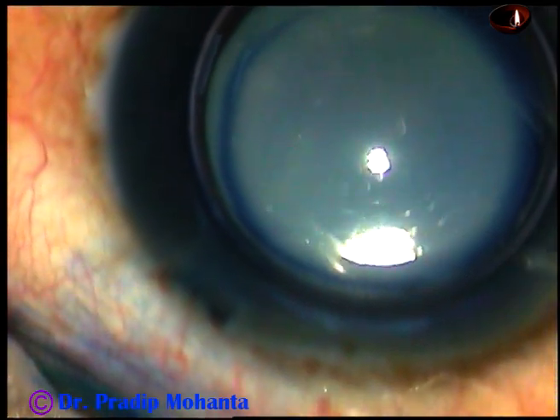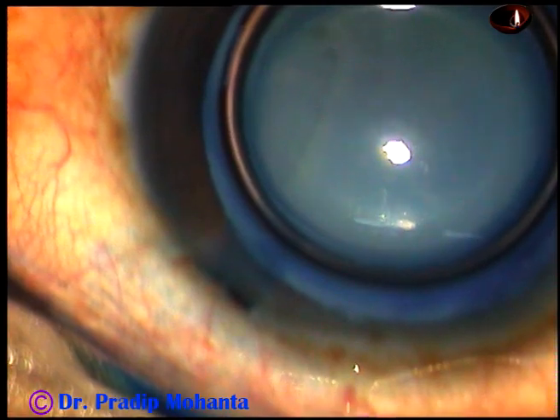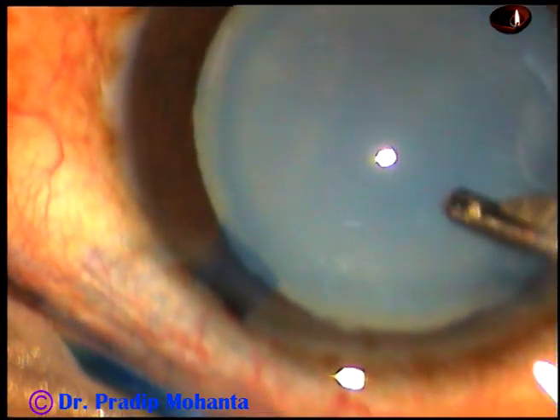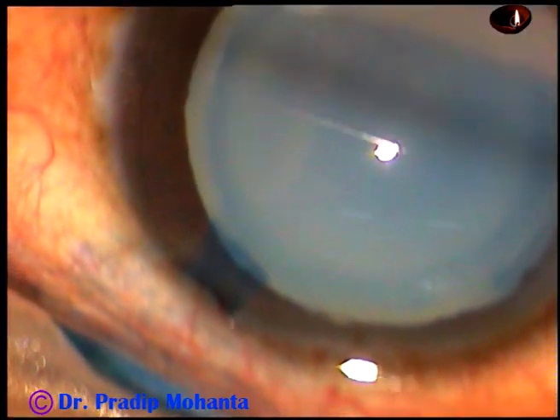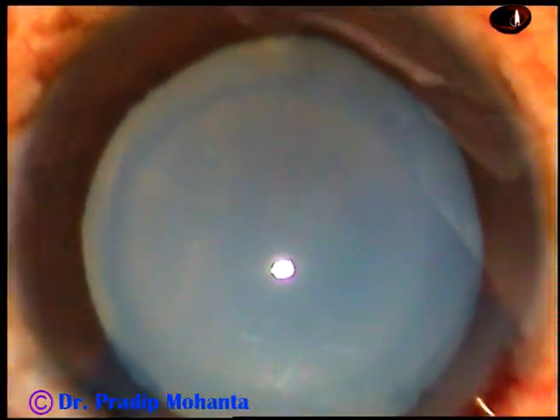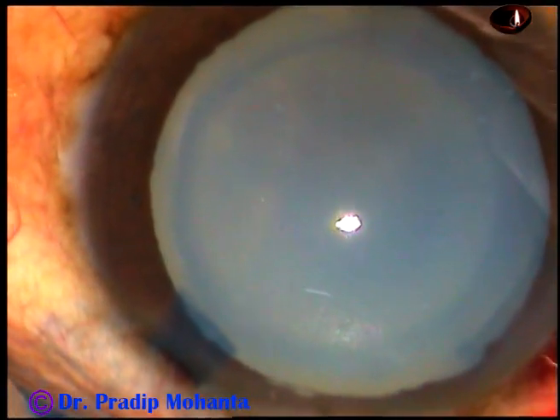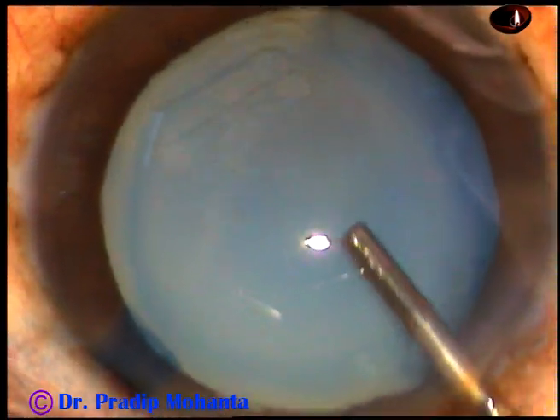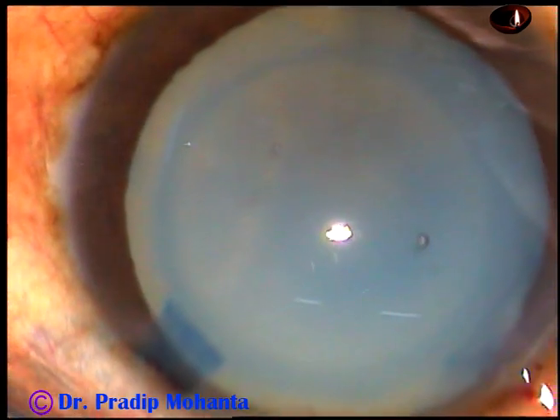This is a real-time surgery, so I don't wait much. In about 12 to 15 seconds, I wash the dye out of the anterior chamber using a 23-gauge Simcoe cannula. And now the anterior chamber is filled up with 2% hydroxypropylmethylcellulose.